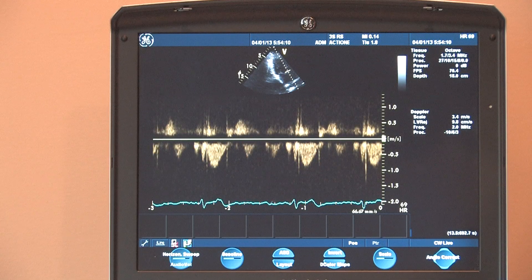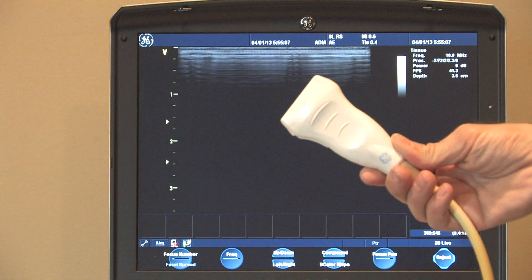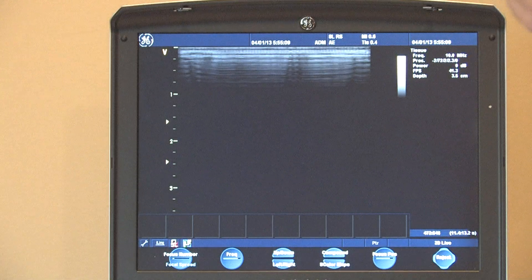It's really a great little system. This is the 8L vascular probe that I'm going to similarly demonstrate.